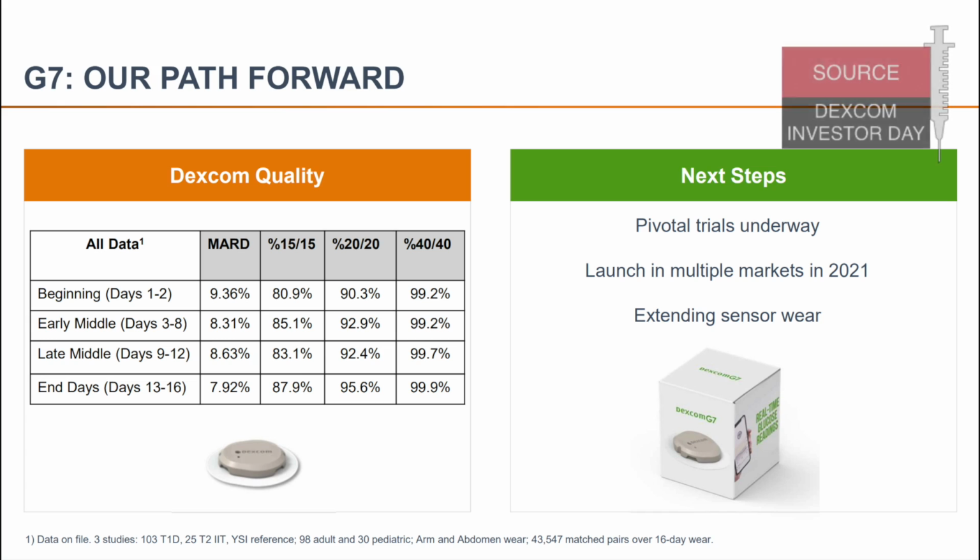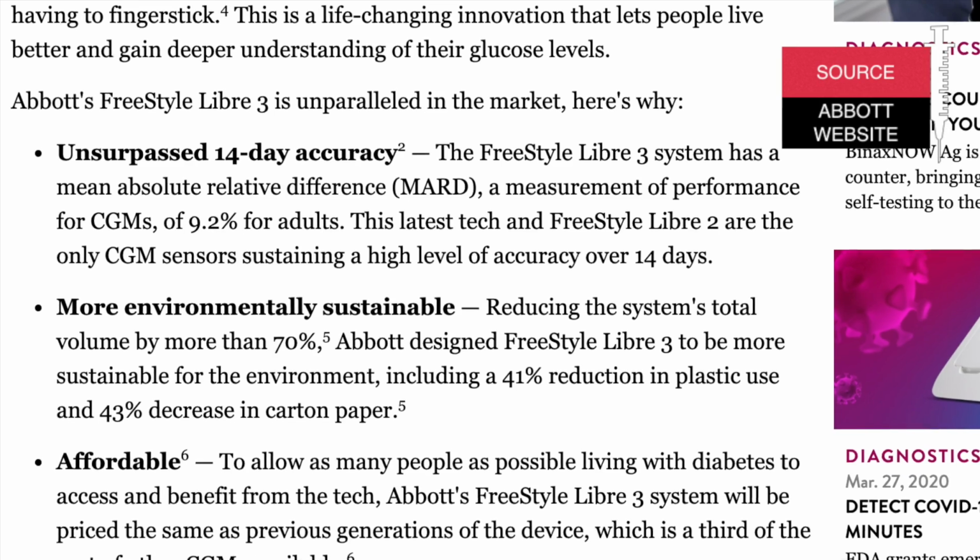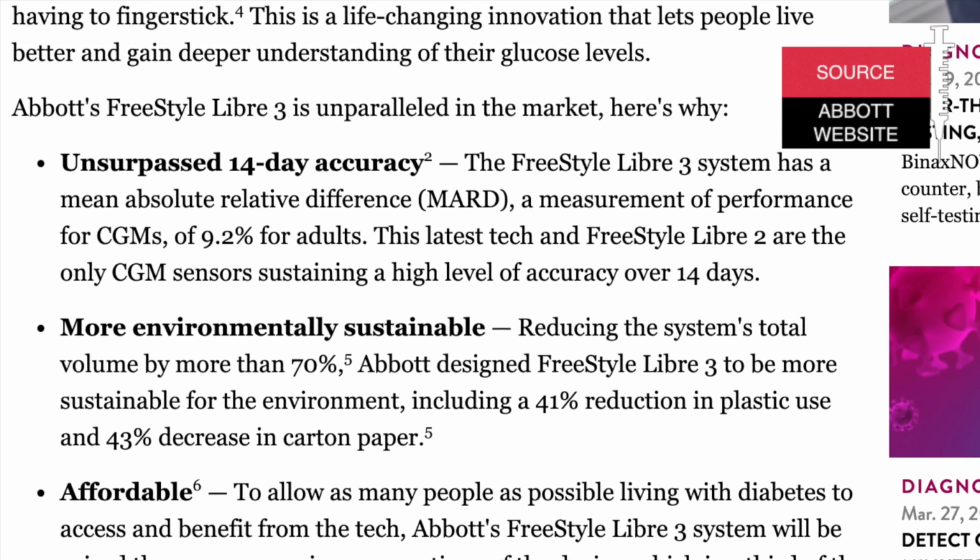When it comes to MARD, it's a bit tricky to compare FreeStyle Libre 3 and Dexcom G7, because both companies share the information in a little bit different format. But from the information shared, it seems that Dexcom G7 shows MARD of approximately 8.5% and Libre 3 shows MARD same as Libre 2, which is approximately 9.2%.